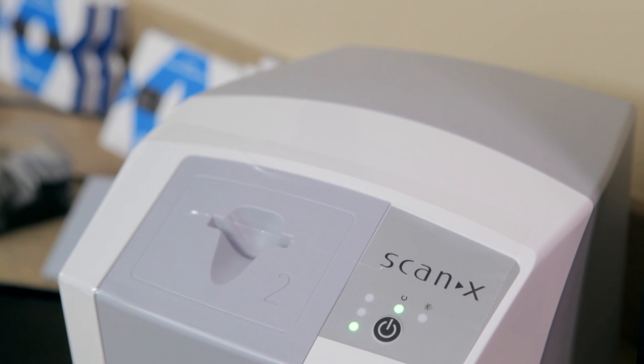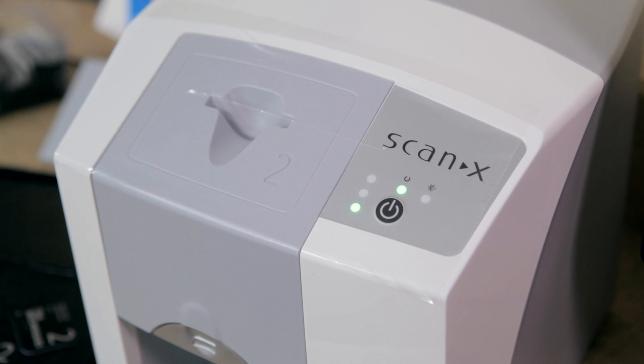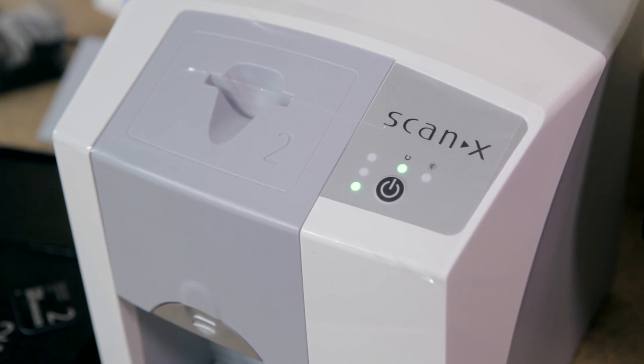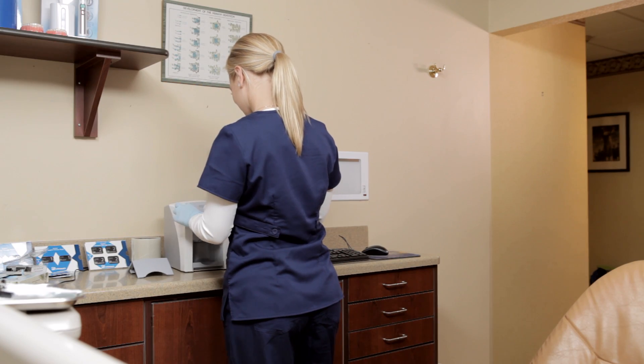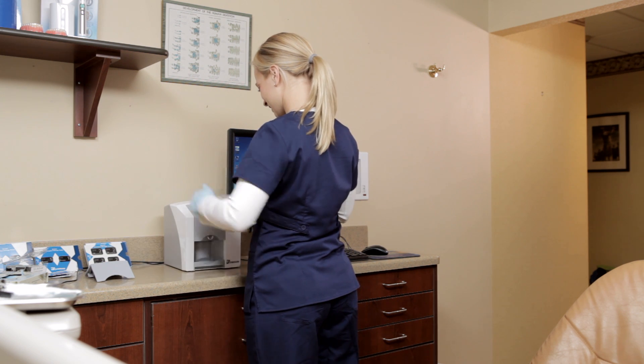The workflow for the ScanX Swift couldn't be easier. Choose the correct plate guide to be used on the Swift unit. The size 0 guide should be used for a size 0 sensor, and a size 2 guide for size 1 or size 2 sensors.